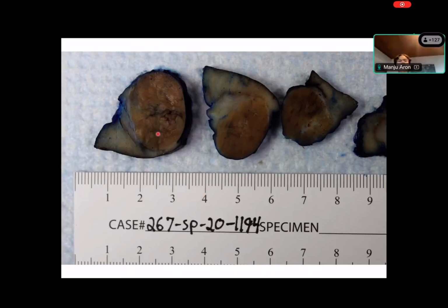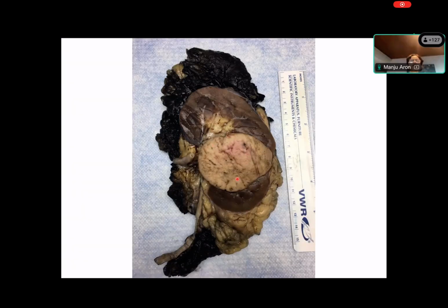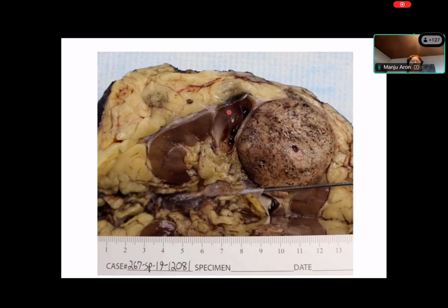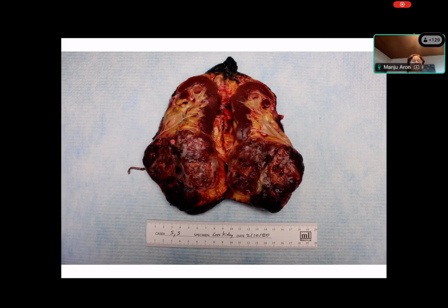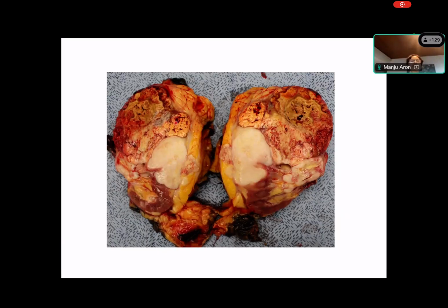Here's another tumor with a similar kind of appearance, darker than the surrounding renal parenchyma. And here is another tumor which is again circumscribed, but it is paler than the normal renal parenchyma. Another example of the same, paler than the adjacent renal parenchyma, but not quite yellow in appearance. Here is another tumor which is very yellow, or we can call it golden yellow in color. Here is a tumor which has a very heterogeneous appearance with yellow areas, areas of hemorrhage. And here is a yellow tumor which has these large areas of gray-white discoloration, which appears much firmer than the surrounding tumor.